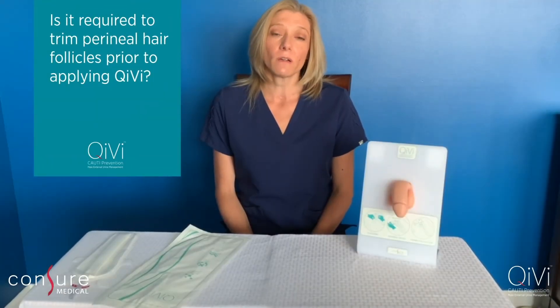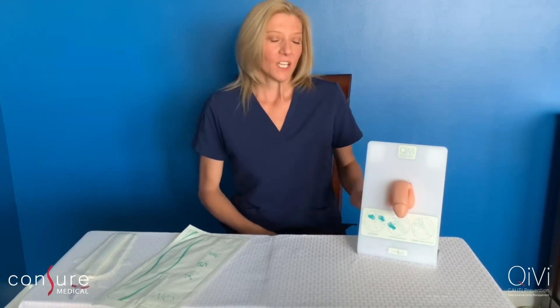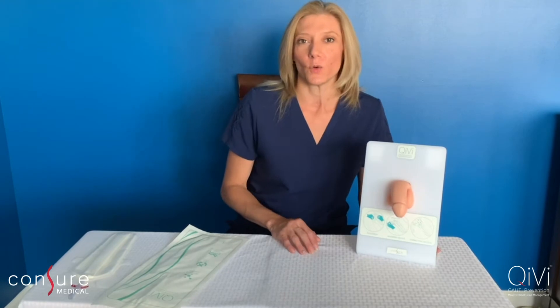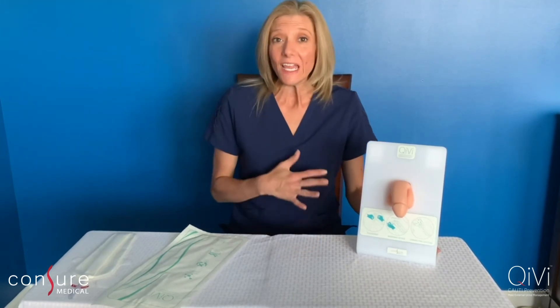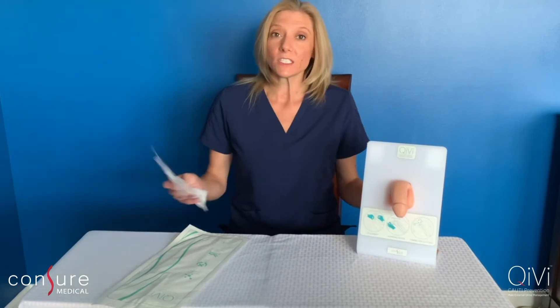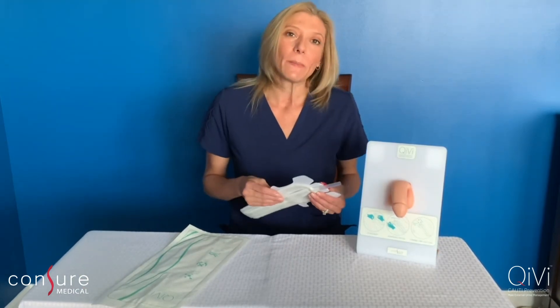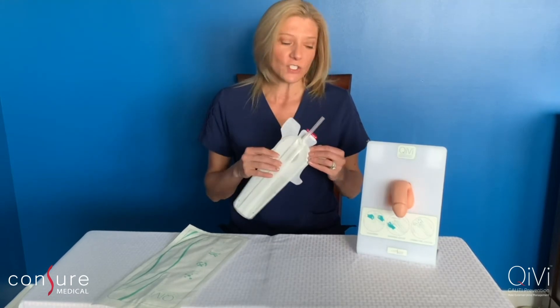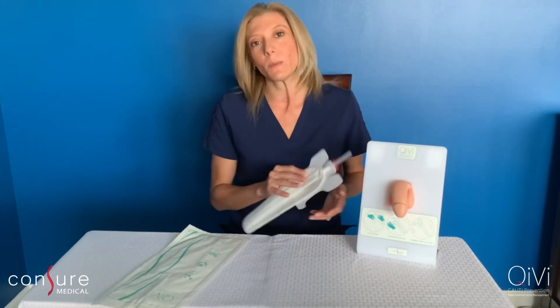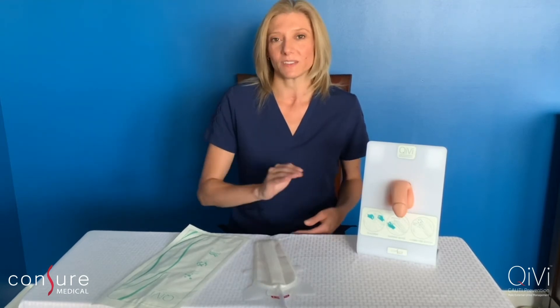Is trimming of the perineal hair follicles required? Not necessarily — it's really going to depend on the patient's hair growth. For coarse, thick hair, trimming is definitely recommended. QV can still work in the presence of hair; however, hair acts as a barrier between the adhesive patch and the patient's skin, and we do want to minimize any barriers so we can achieve the best seal possible.